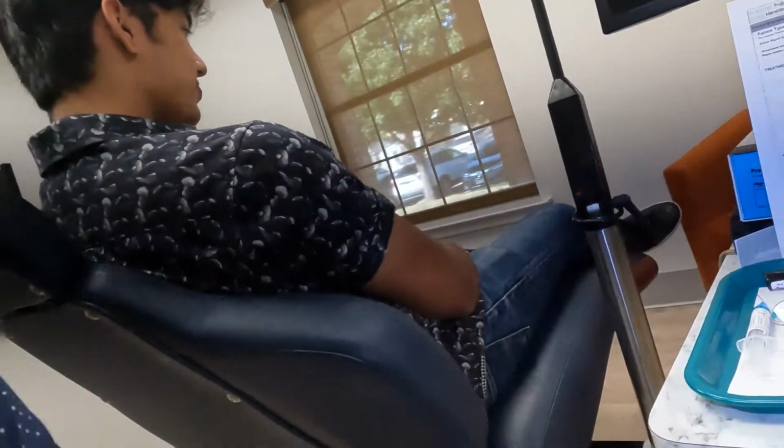Okay, so today I was just telling everybody that we are getting ready to do some shaving in between the teeth. We're gonna show everybody how we do it, and it's gonna be a lot of fun. Anish is getting ready to do some Invisalign, and we're just gonna show you some of our tools for the shaving process. So let's see if you can hear this.